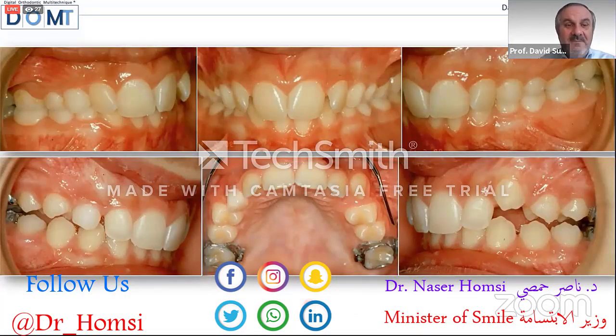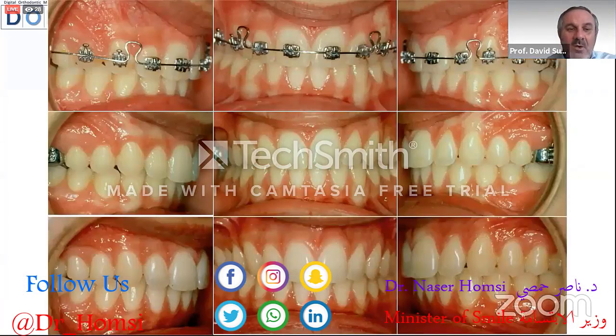Don't use very sophisticated and very expensive appliances, because you can see this case. It's a class 2 division, collapse of the maxillary, and only a headgear was used. Only with the headgear and with a very simple appliance is it enough to treat this patient.